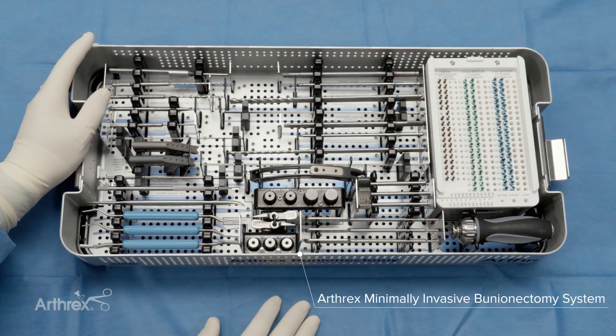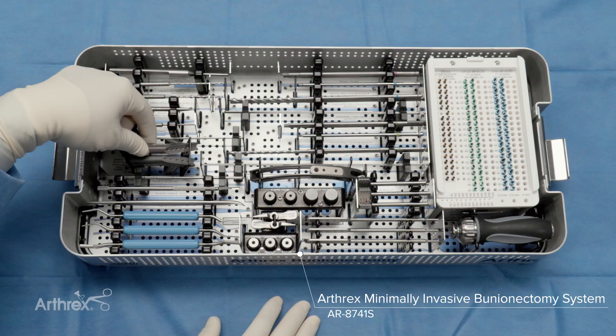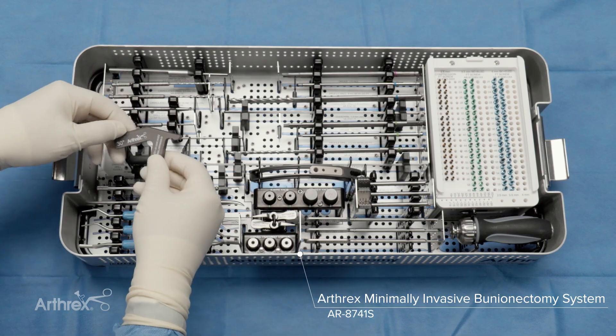Hello everyone. Here we have the Arthrex Bunionectomy set, and I wanted to introduce you to two of the newer additions that we see — and that's the parallel guide.